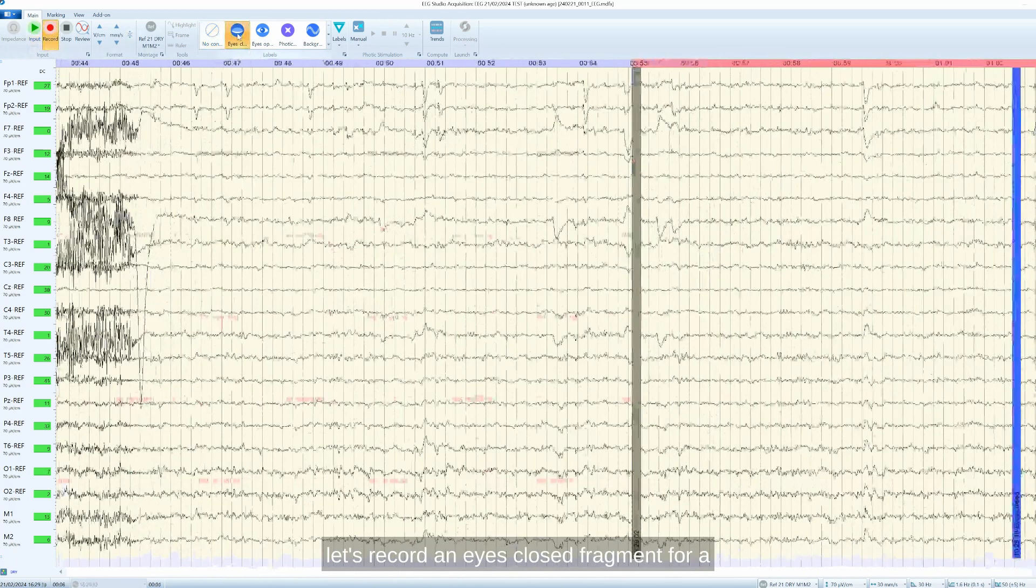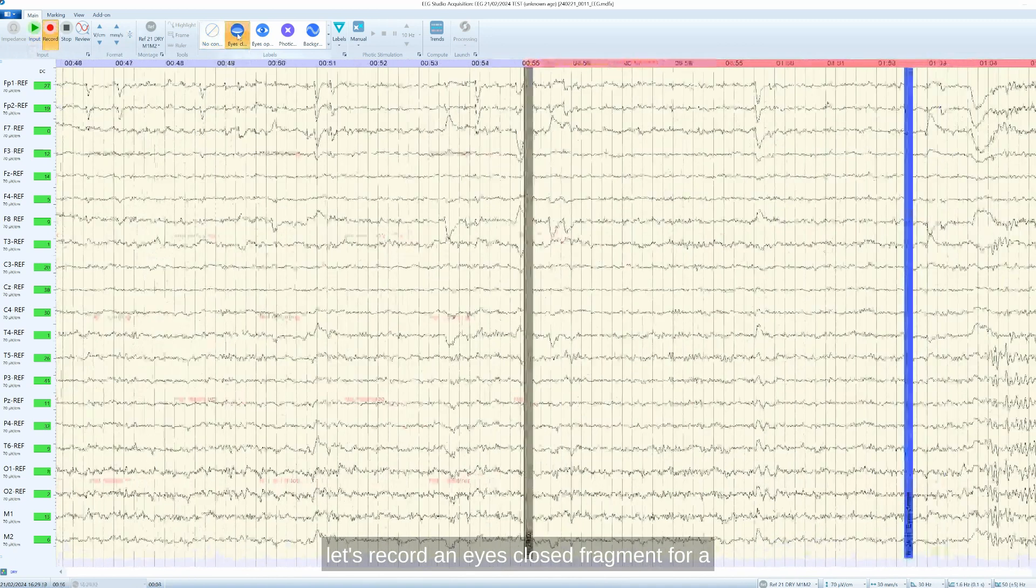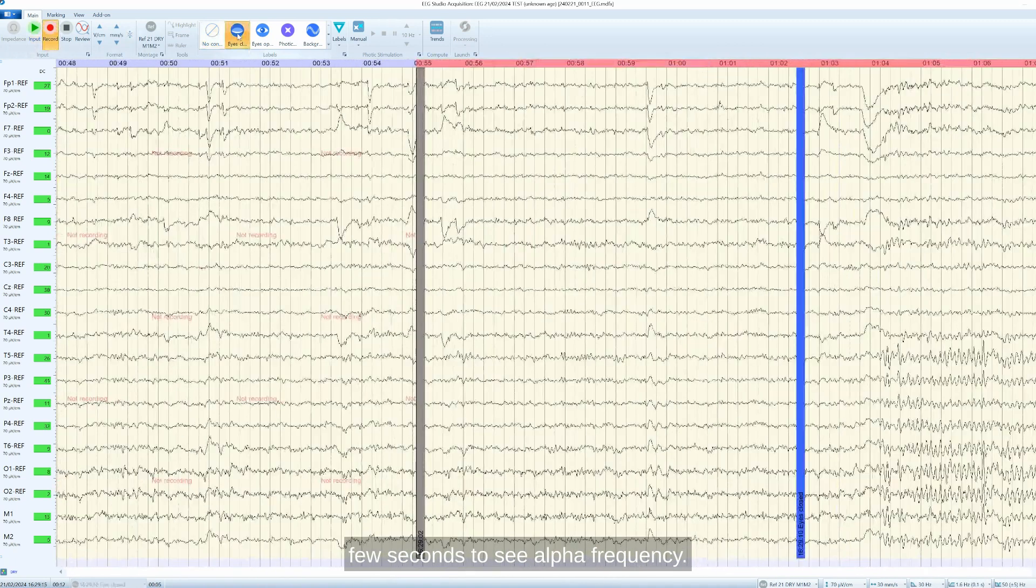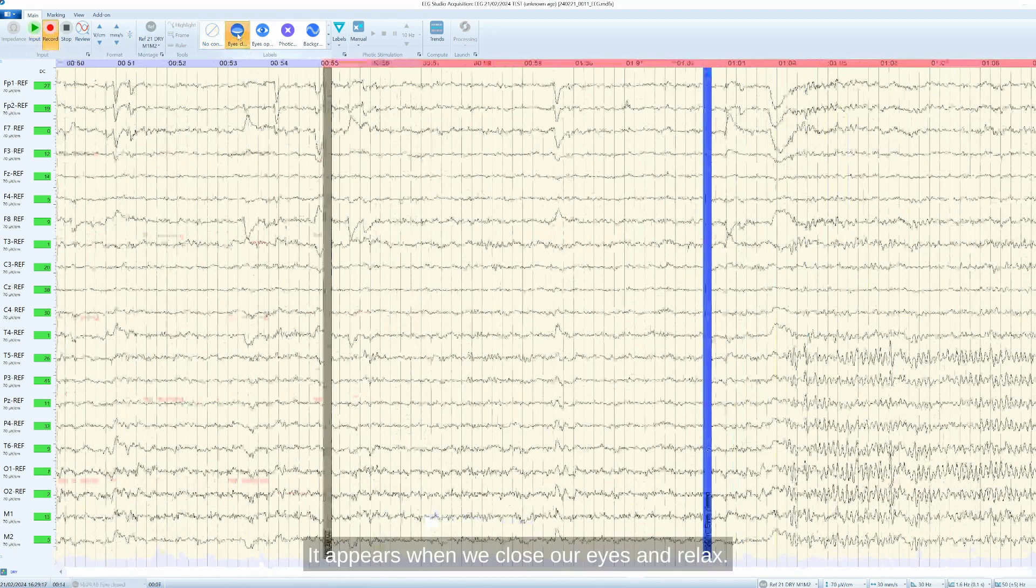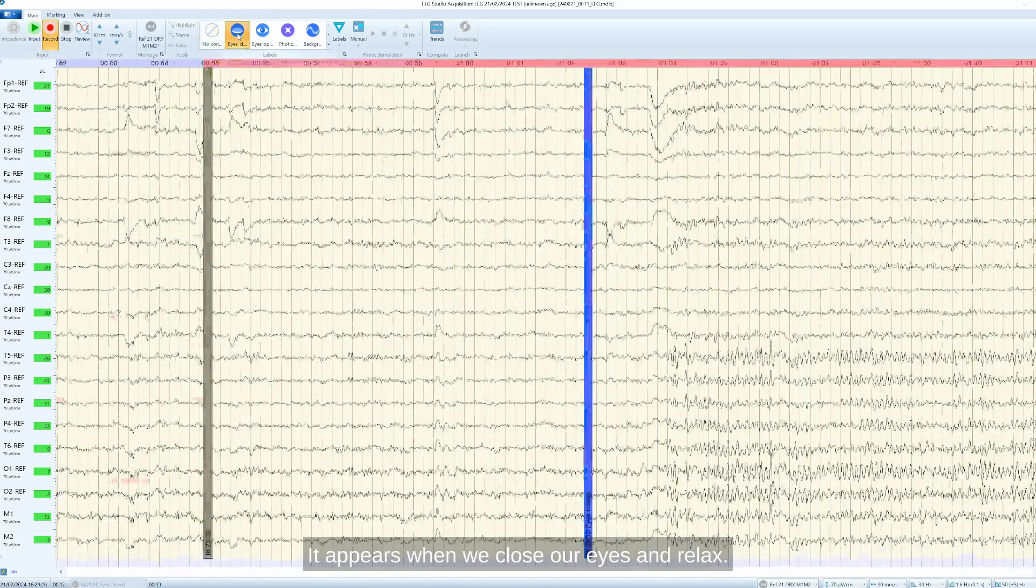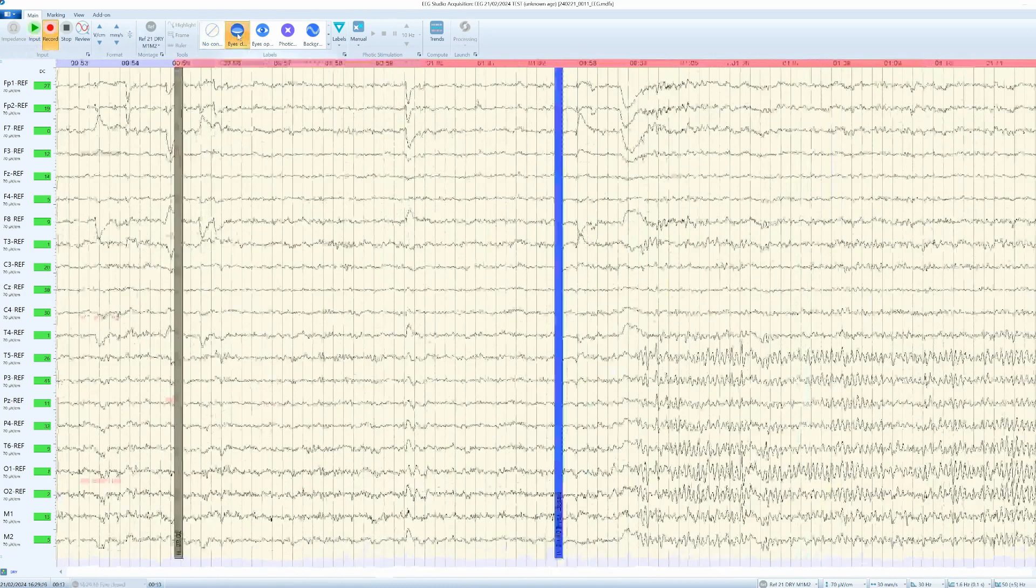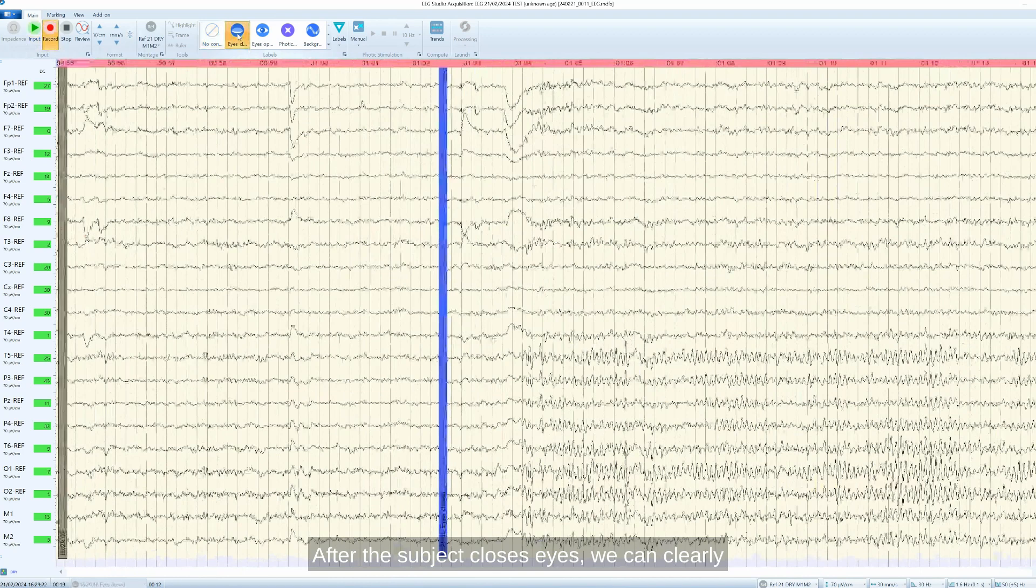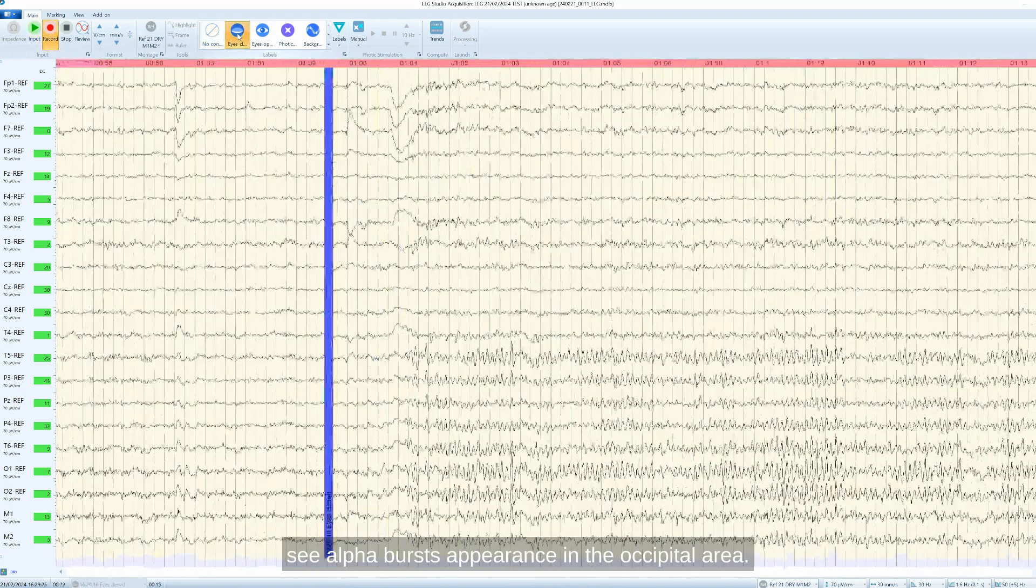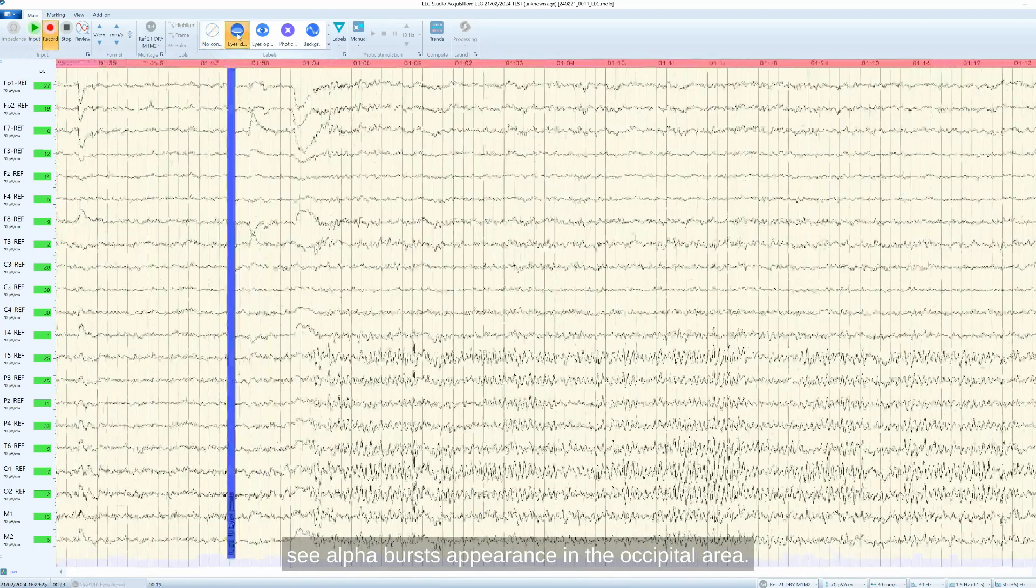Let's record an eyes closed fragment for a few seconds to see alpha frequency. It appears when we close our eyes and relax. After the subject closes eyes, we can clearly see alpha bursts appearance in the occipital area.